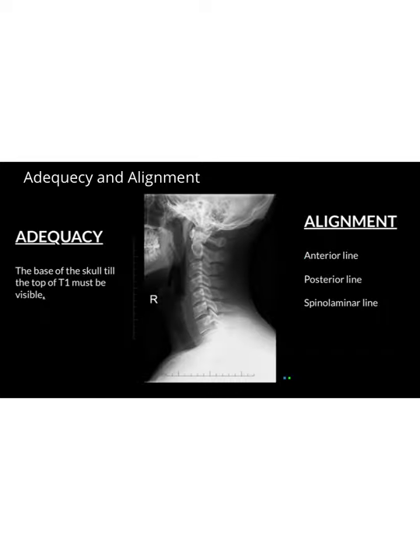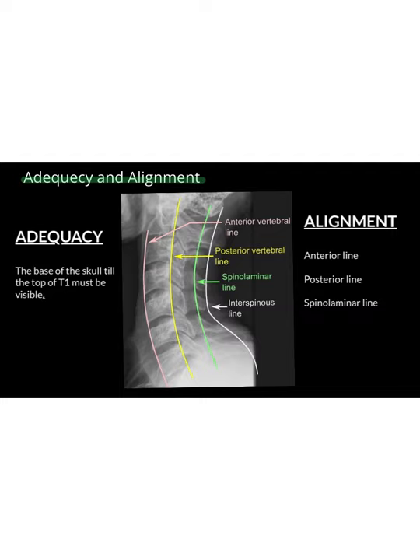A stands for adequacy and alignment on the lateral view. Adequacy dictates that we need to see from the base of the skull all the way to the top of T1. We can see here C1, C2, C3, C4, C5, C6, C7, and then the top of T1. Alignment dictates that we have three uninterrupted lines: the anterior vertebral line on the anterior aspect of the vertebrae, the posterior vertebral line on the posterior aspect, and the spinal laminar line on the anterior aspect of the spinous processes.